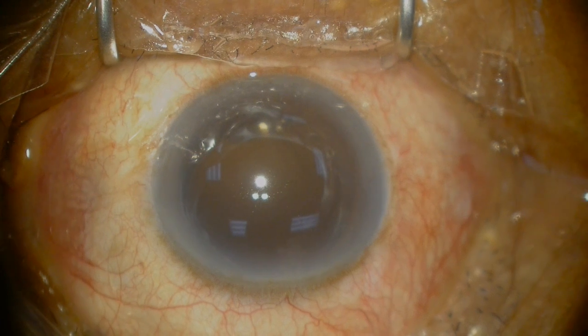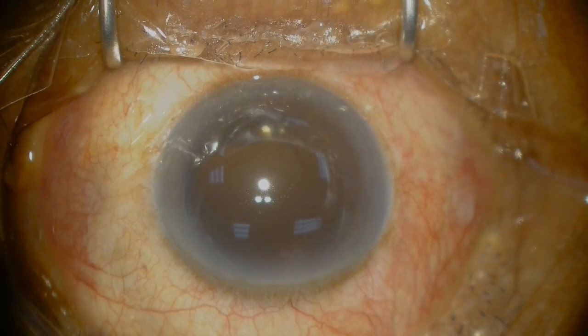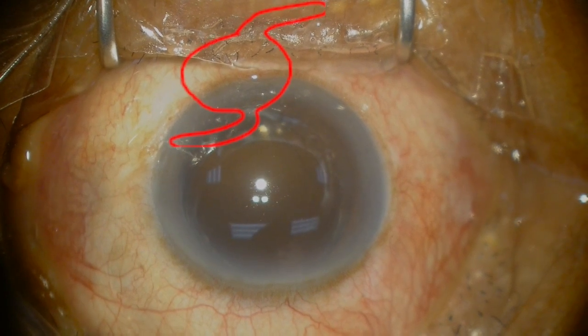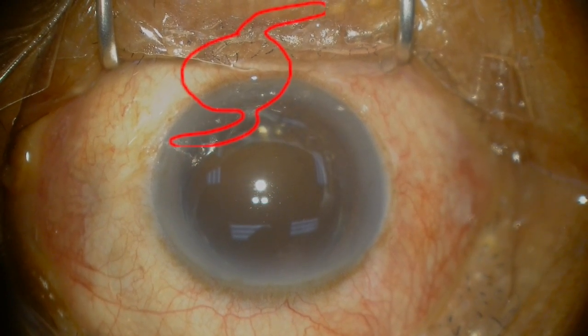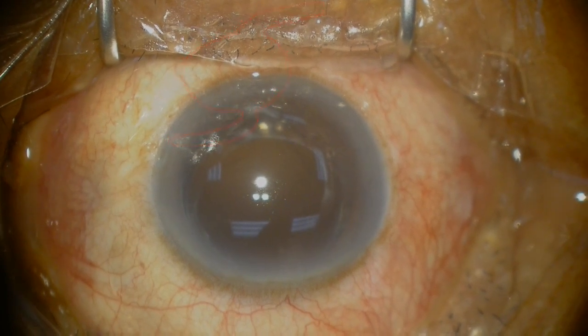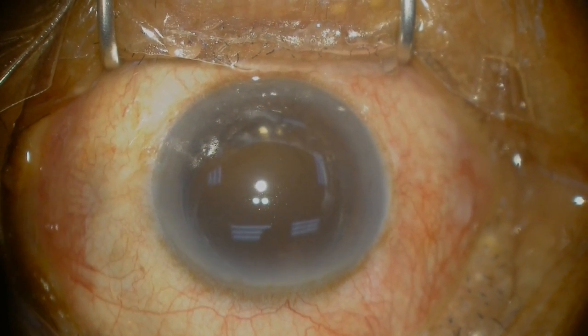This is a video of a patient that was referred to me with a subluxated one-piece intraocular lens. The cartoon here highlights where the lens appears to be sitting and it also seems to be flipped. So the plan is to explant this one-piece lens and intrasclerally fixate a three-piece intraocular lens.